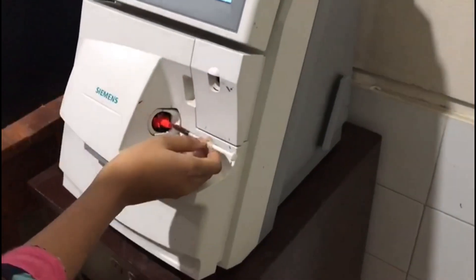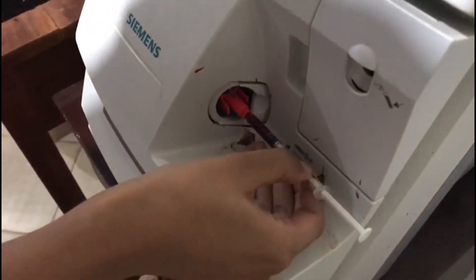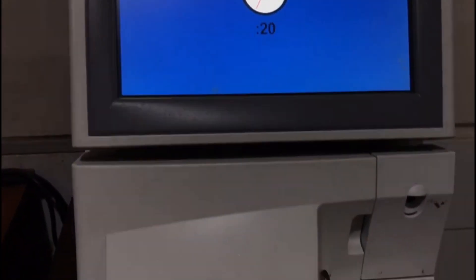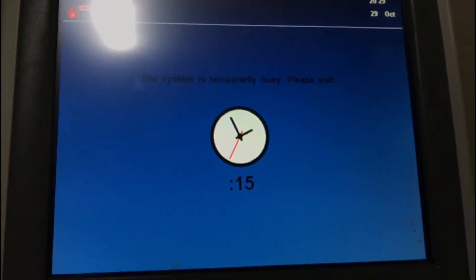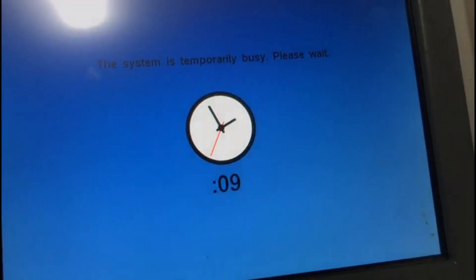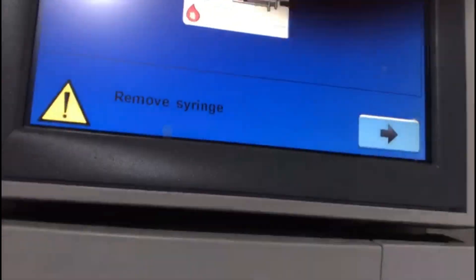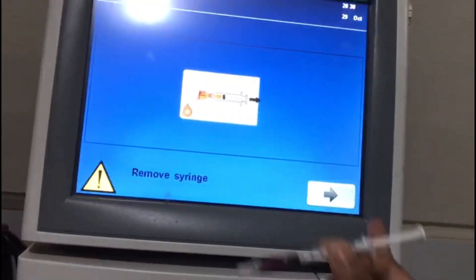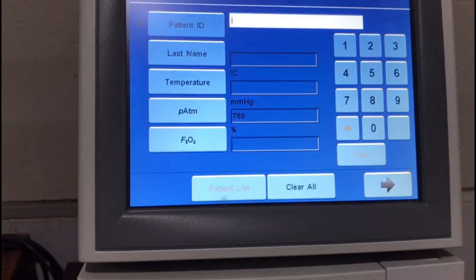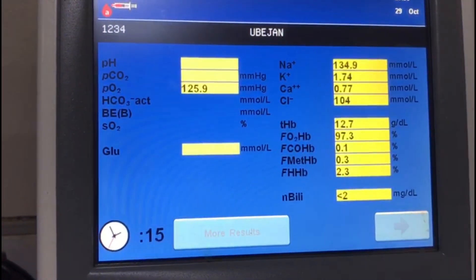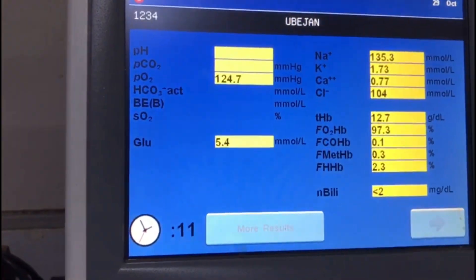Insert the syringe into the ABG analyzer machine and wait a few seconds. When the sign to remove the syringe appears, remove it and press the OK button. Wait a few more seconds and you will get the result.